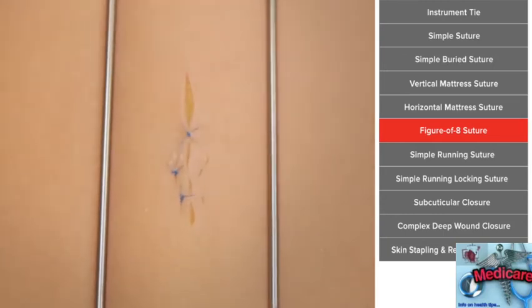A figure of 8 is just as strong as a horizontal mattress would be, but it's faster. And I would say cosmetically the scar would not be as good, so it's good for fascia in deep areas.